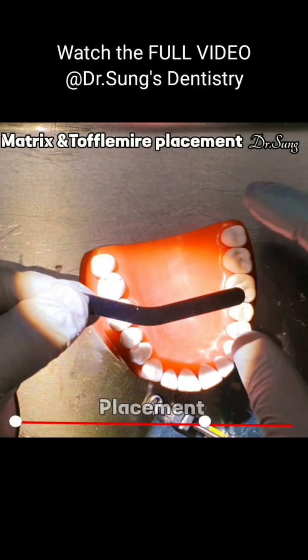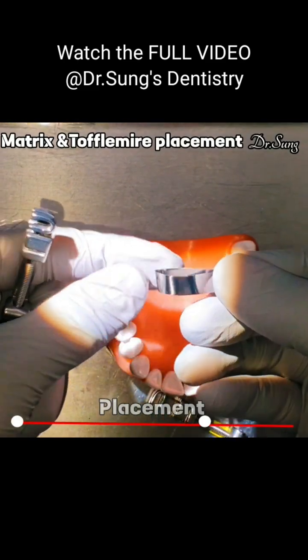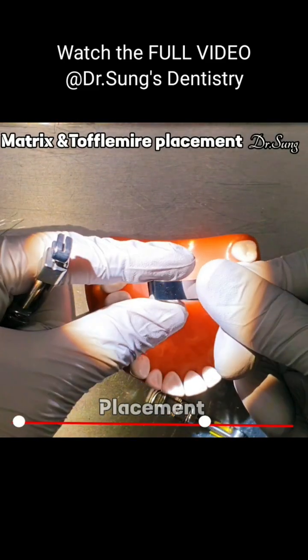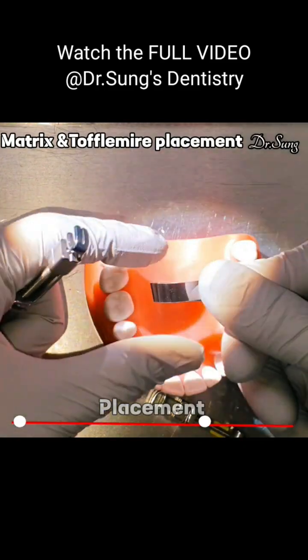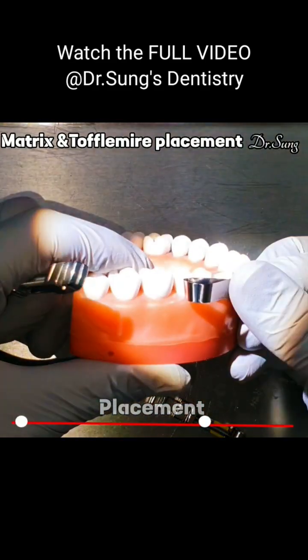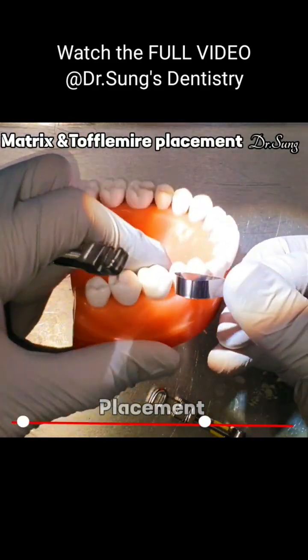So here we have the Tufflemeyer, and we see that V — so if you bend it, we see that this surface is wider, so it goes like this. So this one is wider and shorter. The wider surface always goes to the occlusal surface, because as you can see, the occlusal surface table is wider than the gingiva.